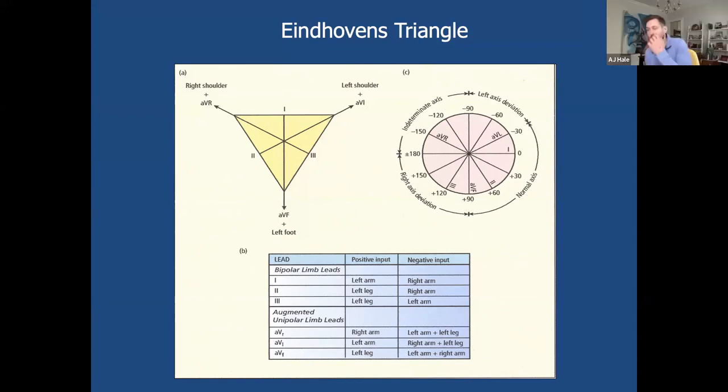Yeah, so I'm not sure who originated it, but we do have an algorithm called QuickOpt, which evaluates what the LV-RV offset timing should be. We don't use actual surface EKGs. It uses EGMs as a surrogate, because one argument to all this is we don't know where the lead is placed half the time, right? Because it was placed 5 years ago and now we're doing follow-up because they have heart failure symptoms. But what we're trying to do is get the most electrically narrow QRS. So we can use our surrogates in the EGM and then compare it to a surface 12-lead EKG and just try to optimize for the most narrow, electrically efficient QRS, I guess is the way I'd say it.